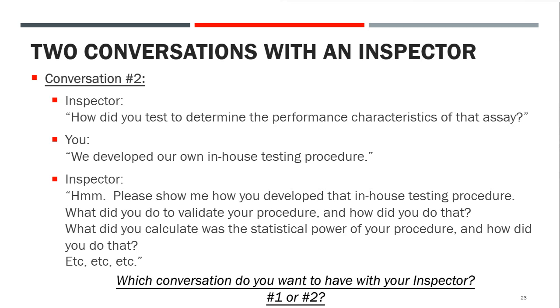So the question you need to answer is there at the bottom of the screen. It says, which conversation do you want to have with your accreditation inspector? Conversation number 1 or conversation number 2? Your decision. People want to have conversation number 1. Follow the CLSI protocol. The inspector says, thank you very much. Most times, most places, that's pretty much how they work.